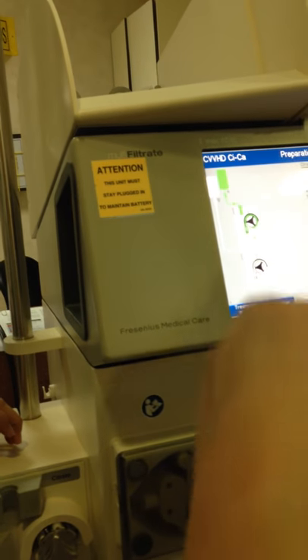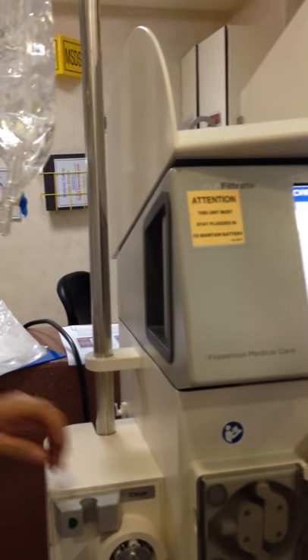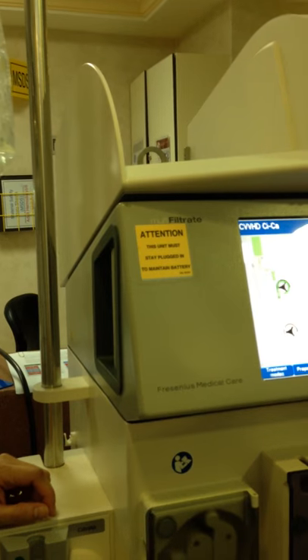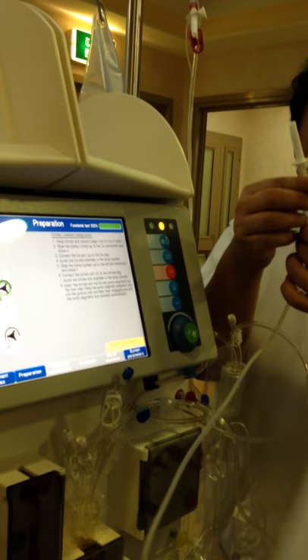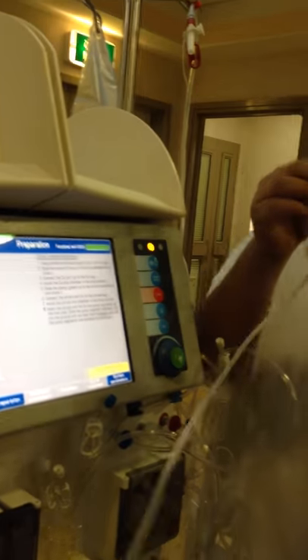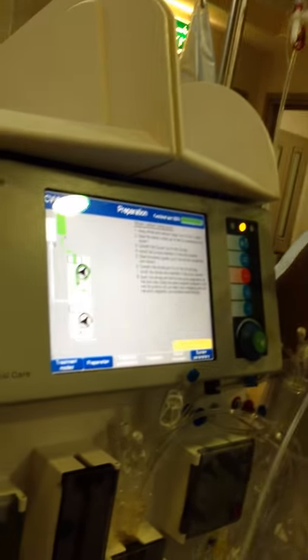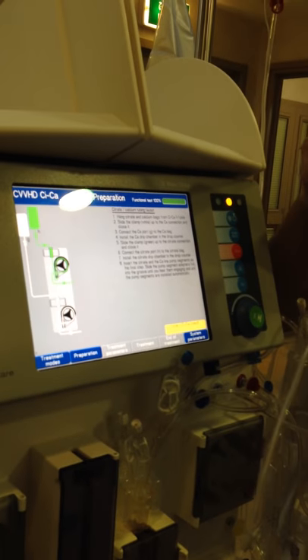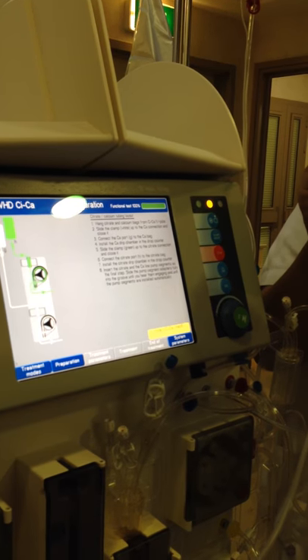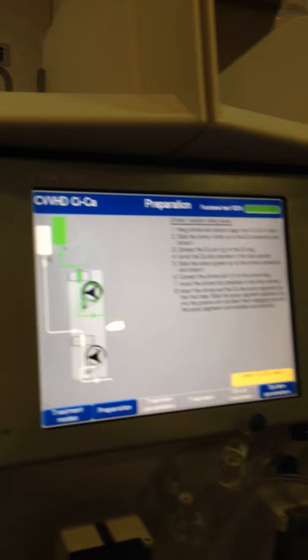Slide the clamp white up. Slide the clamp. Do not make a boo-boo on this, because if you make a boo-boo, you're going to be lost. What is boo-boo? Okay. Please read. This is very important. Slide this and clamp. And I'll explain to you why. And make sure this one is not on the side. It's clamped, okay? Clamp.